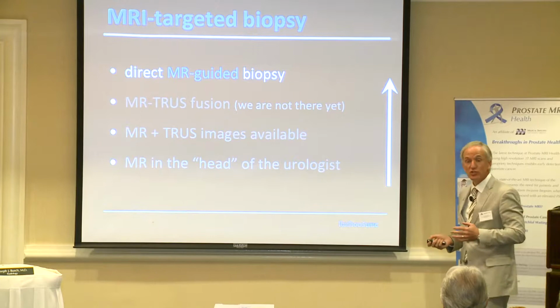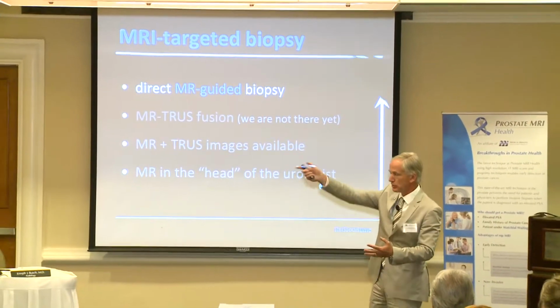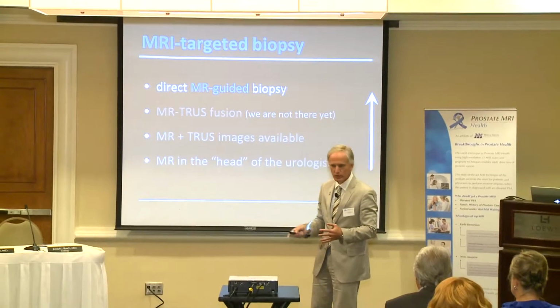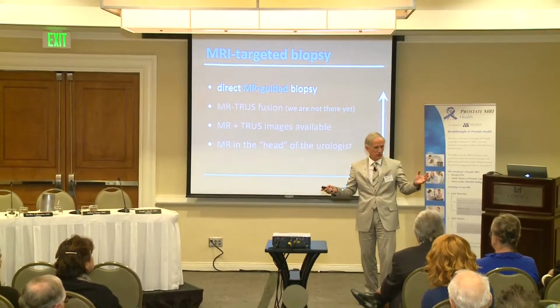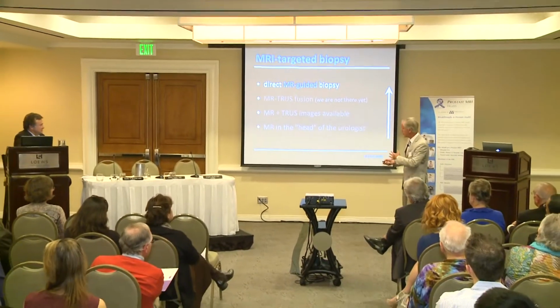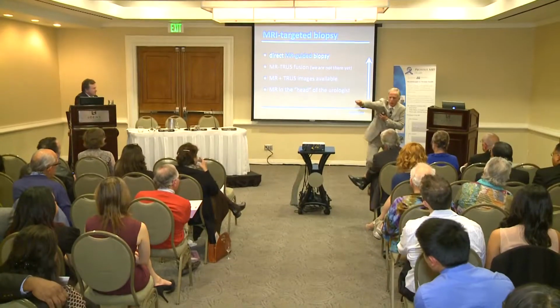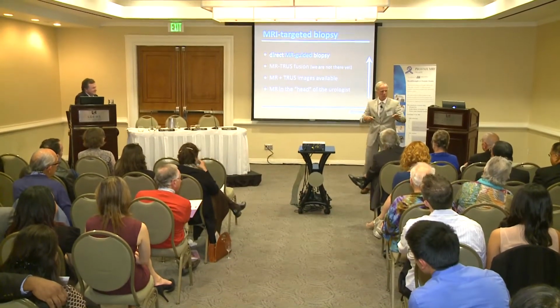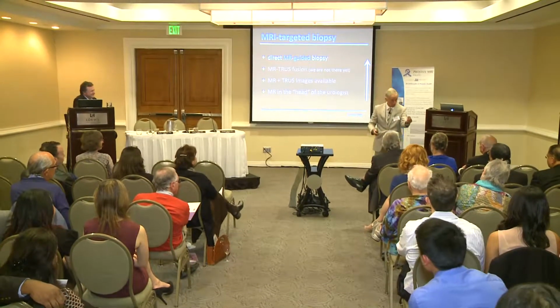Now, you can do a direct in-bore MR biopsy. That's good. Brad can do it. Not yet, but he has to learn it, or his team. Joe Bush can do it, but not too many radiologists can do that. So, how to bring this information now to the urologist? Because he doesn't like the MR bore. He needs to have long arms, and MR is, well, with magnetic things. You don't like it, do you? You want to have something in your office with ultrasound.